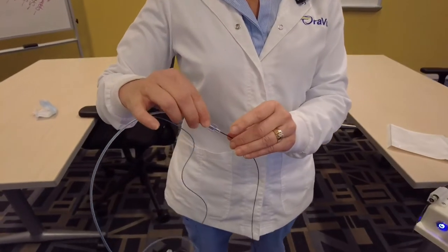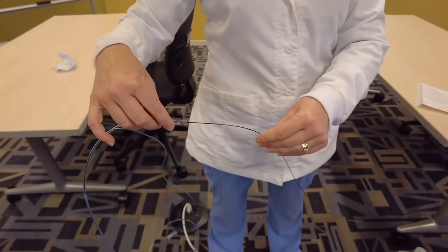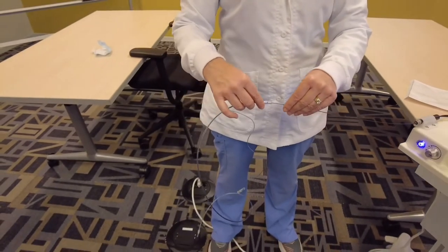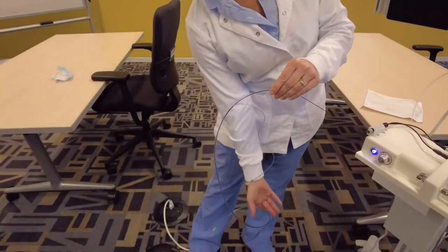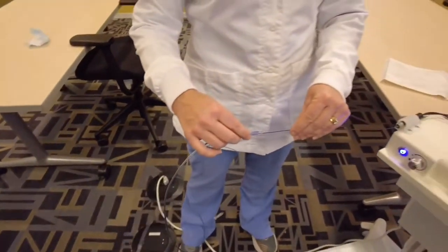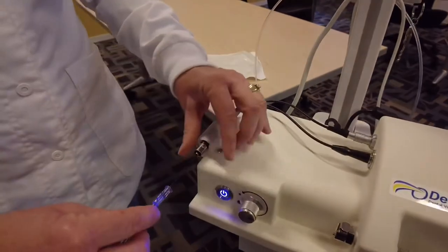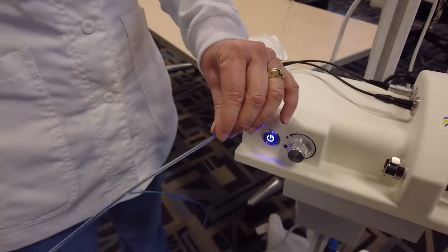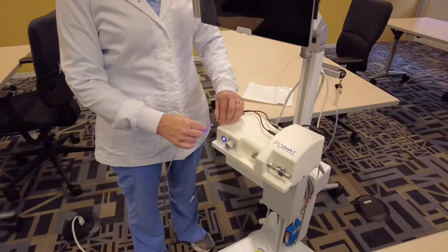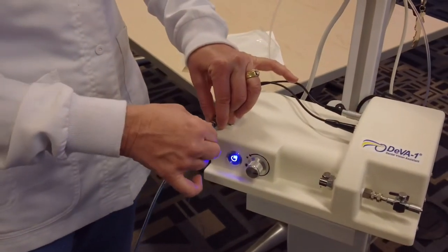Gently insert the fiber into the sheath covering and thread your fiber through. The light is on so you can always see where the tip of your fiber is. Continue to thread it and stretch it out if it gets hung up, then continue to hold it up front and tighten here.